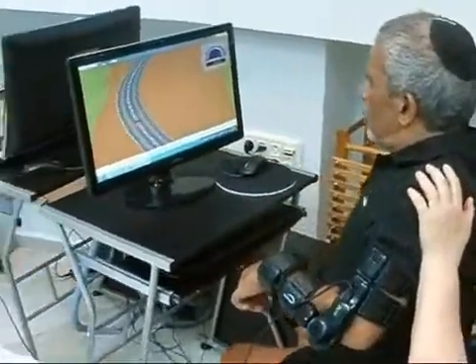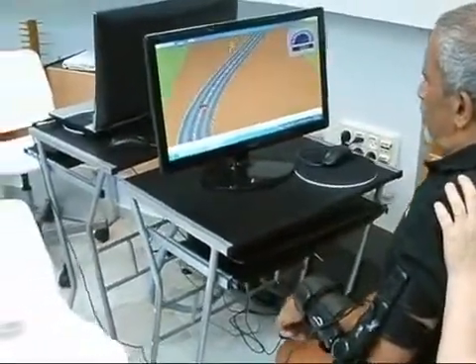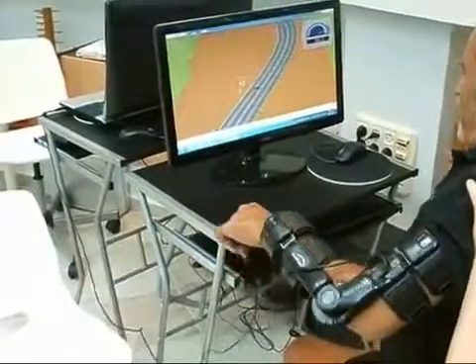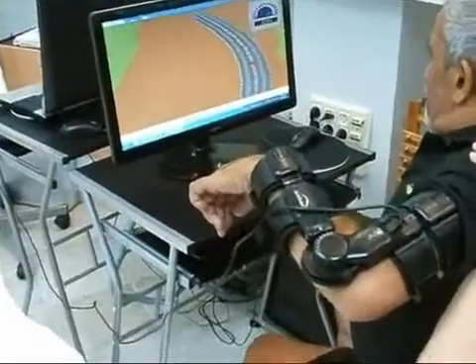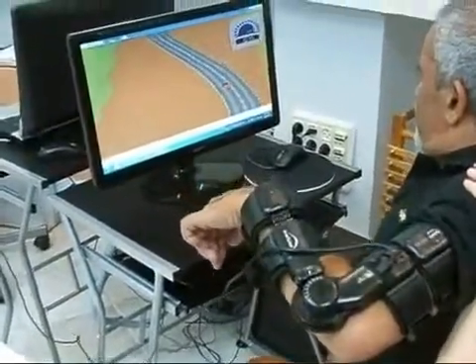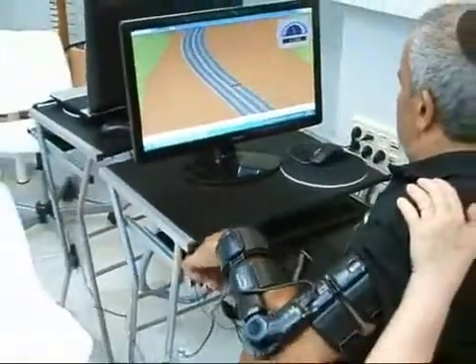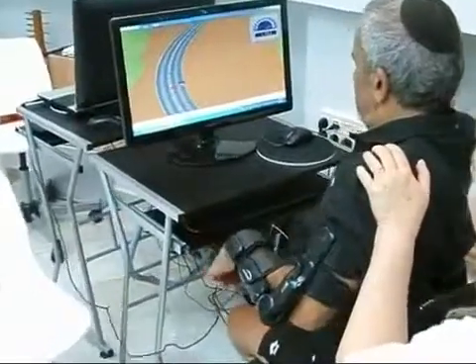Here we see the patient performing intensive active abduction and adduction exercises, again according to his movement ability. The patient can use the Arm Tutor in the clinic and the home care environment.